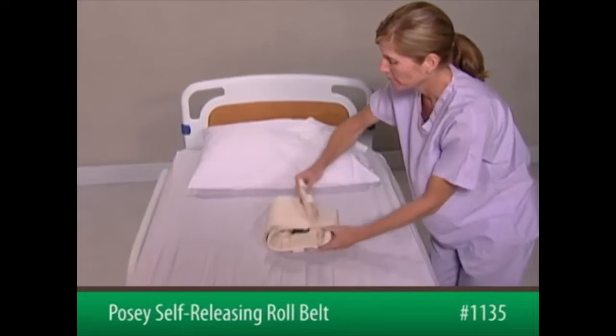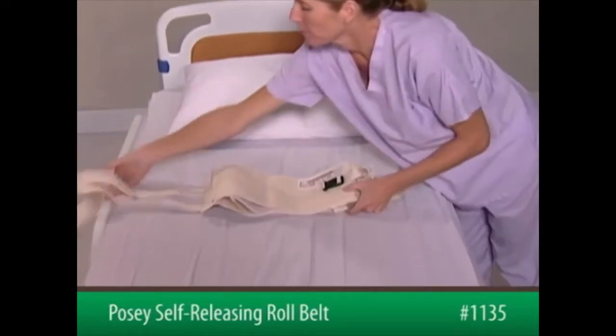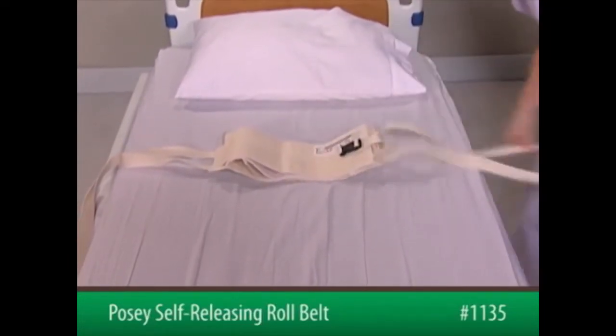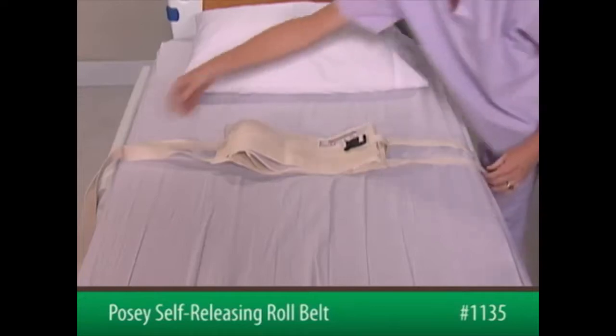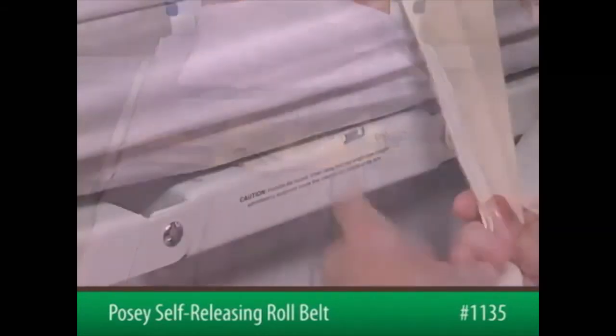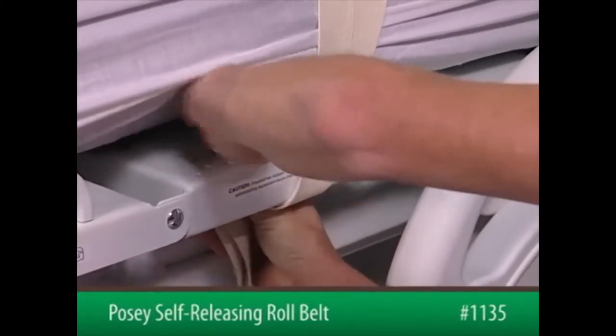To begin, center the belt across the mattress at waist level. The label will be face up toward the head of the bed, and the long straps will hang off both sides of the bed. Attach the two long straps on each side at waist level, out of the patient's reach. Wrap the straps around the outer side of a movable part of the bed frame.